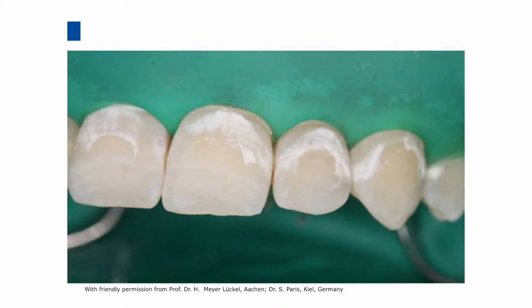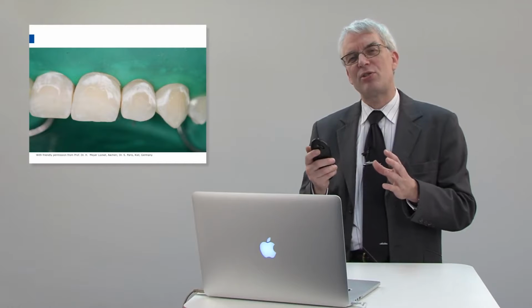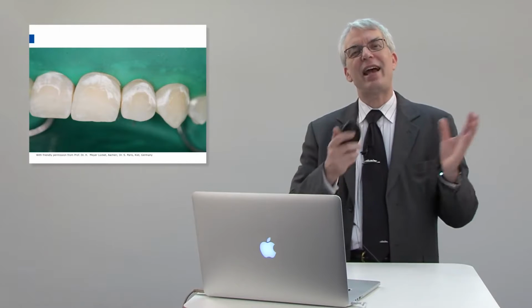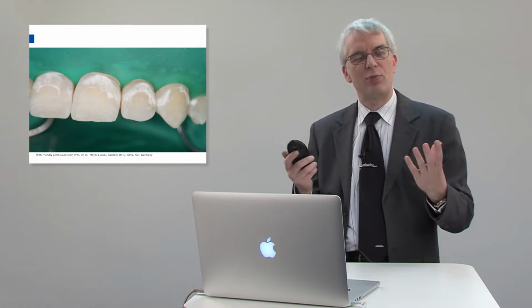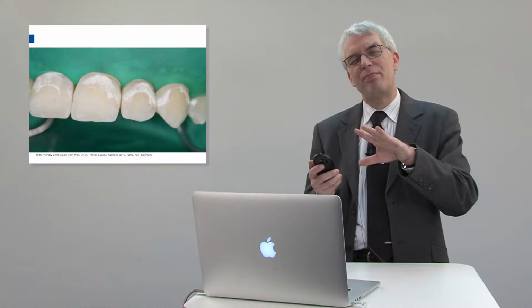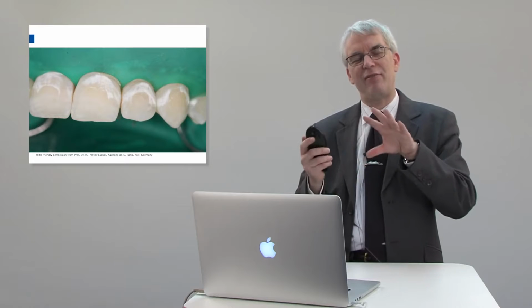And this is what you should see. The brown spots have disappeared. If you don't see this, this is a very essential stage, which I would call the etch and watch stage of the treatment. This stage gives you the option to see the future aesthetic outcome of your treatment. Because when you now apply ethanol, which is the drying step, you would see that the ethanol seeps into these lesions and makes them partially disappear. So if you see this effect, everything is good.